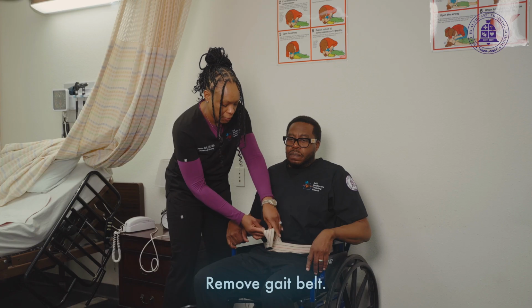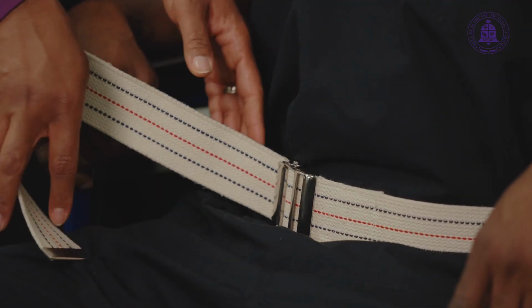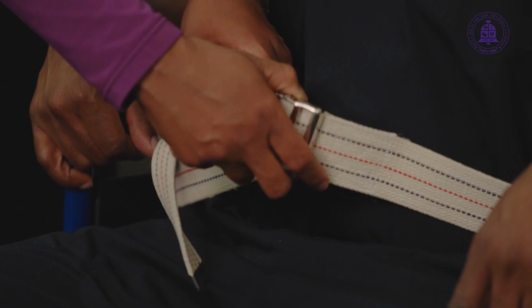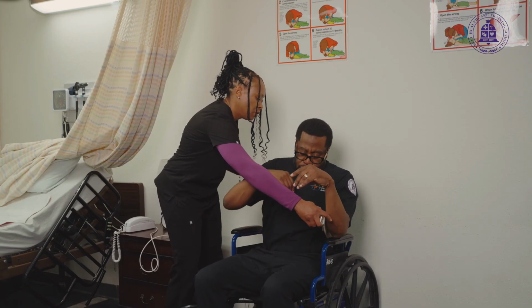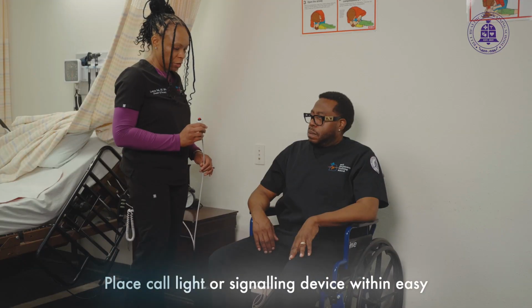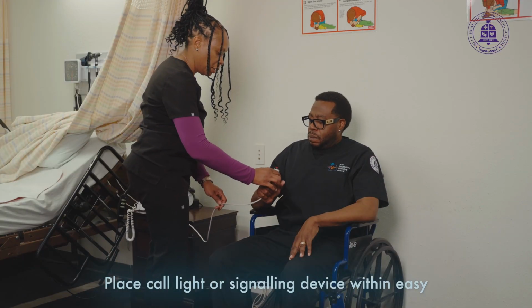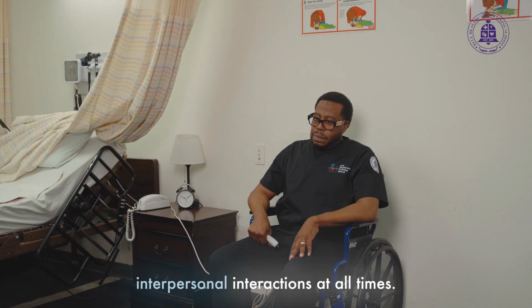Remove gait belt. Place call light or signaling device within easy reach of the resident. Maintain respectful, courteous, interpersonal interactions at all times.